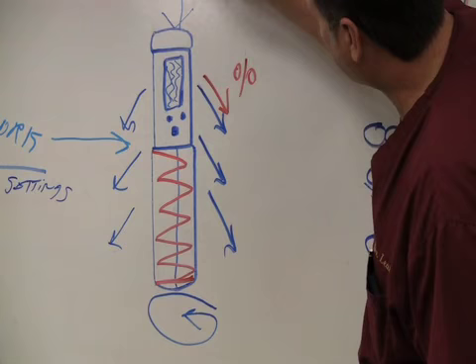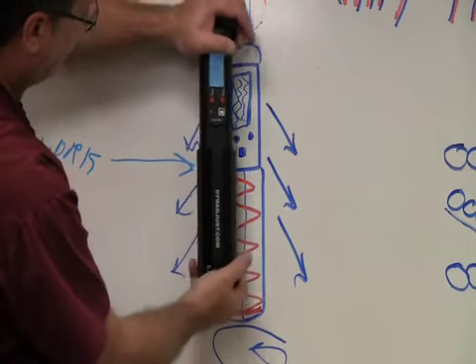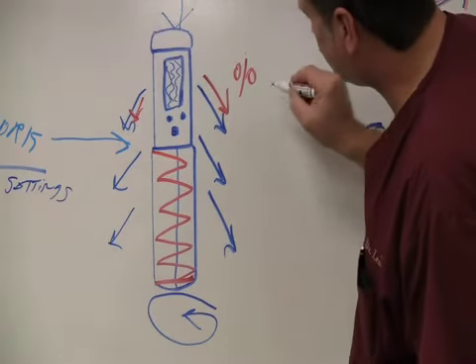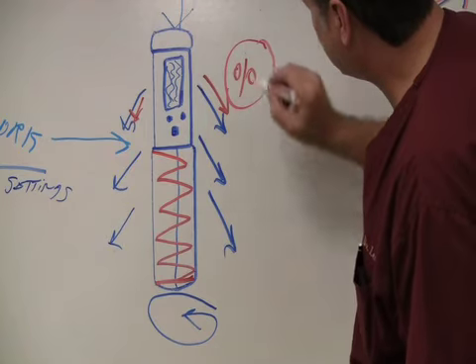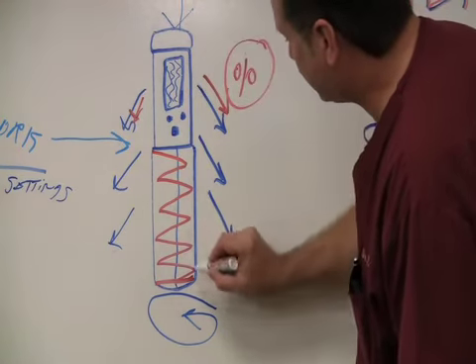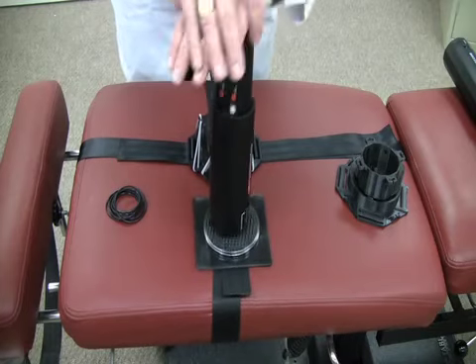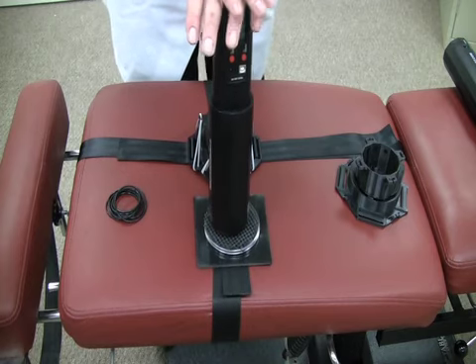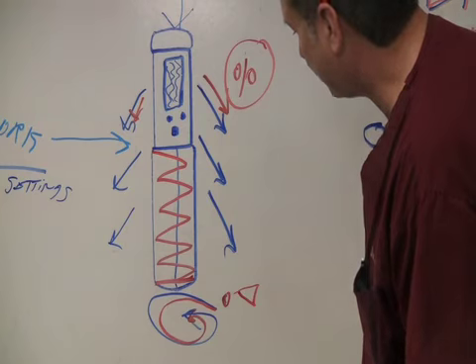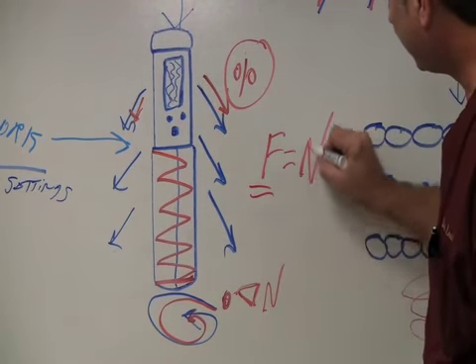from neutral. So if you produce a thrust, your intention is to produce a thrust straight down. If you deviate in any direction, forwards, backwards, or side to side, it reports that in percentages of deviation from neutral. And along the longitudinal axis, the unit reports the deviation from a perfectly neutral thrust in degrees of change from neutral. And the total force of each adjustment is reported in newtons.